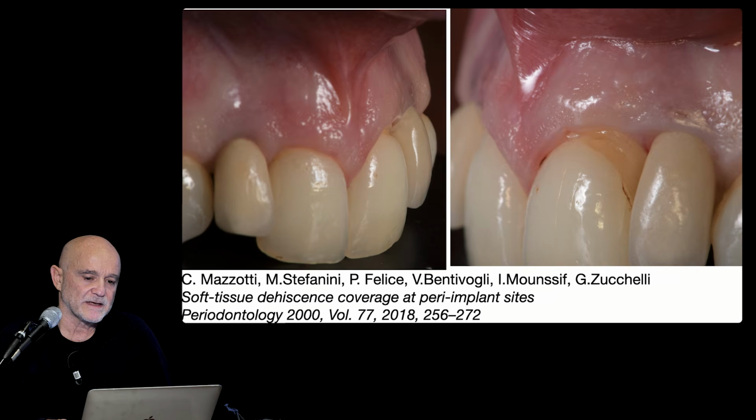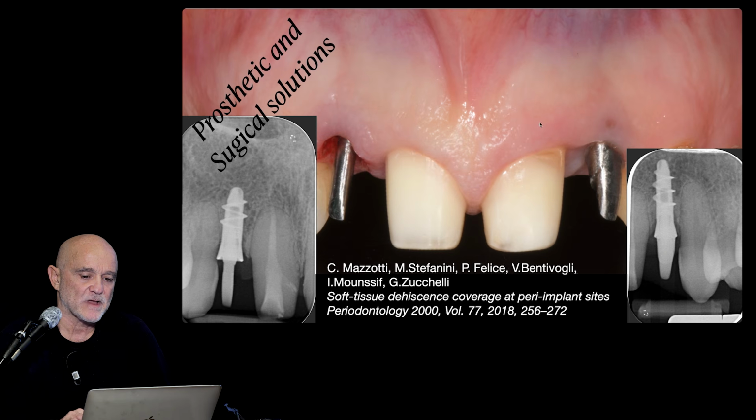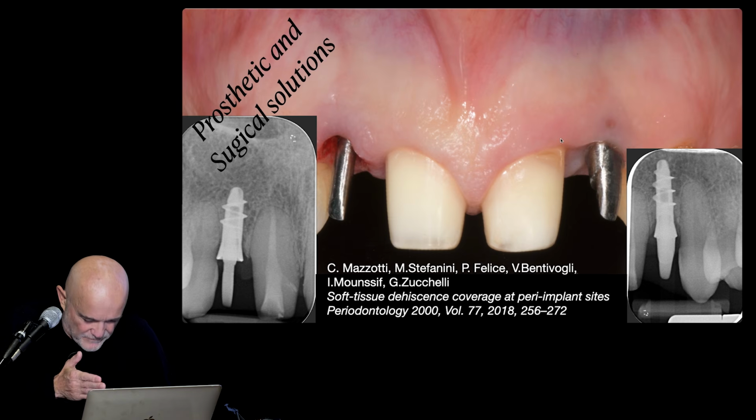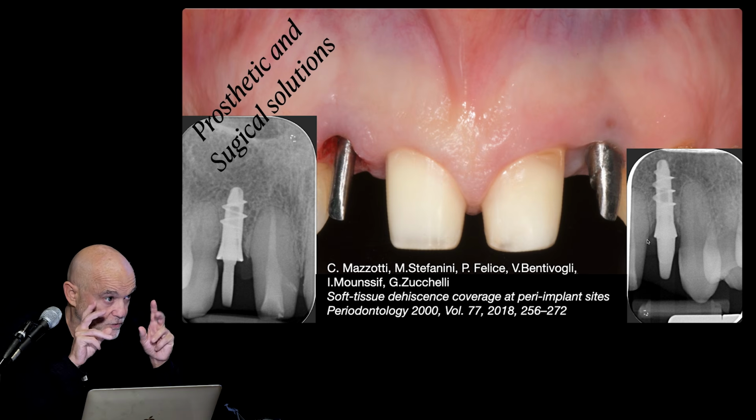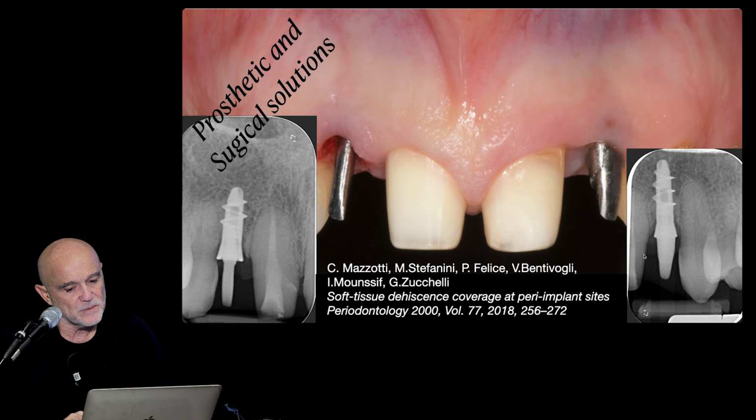So we gain space. How can we gain space? Reducing the abutment as much as possible and making a sort of crestal preparation of the abutment, like BOPT, if you want to call it. So the distance between the abutment and the adjacent natural abutment is increased so much that now we can gain soft tissue.